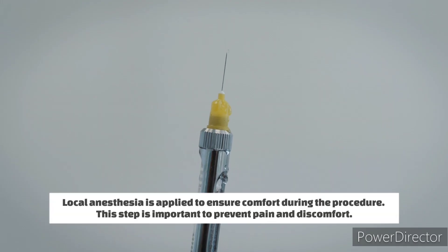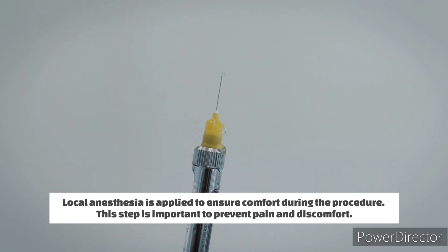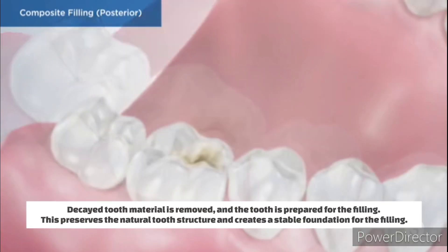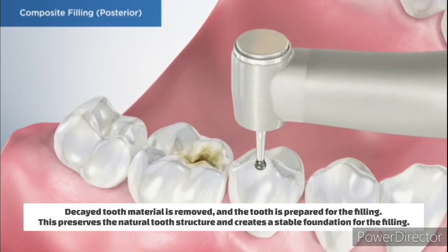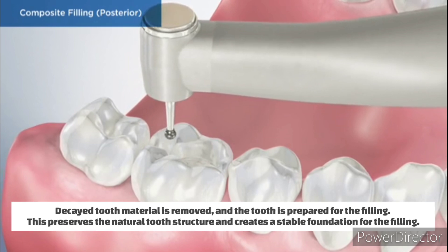Numbing the area: local anesthesia is applied to ensure comfort during the procedure. This step is important to prevent pain and discomfort. Removing the decay and preparing the tooth: decayed tooth material is removed and the tooth is prepared for the filling. This preserves the natural tooth structure and creates a stable foundation for the filling.